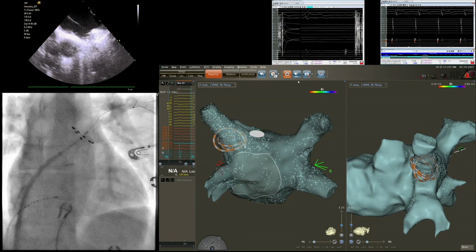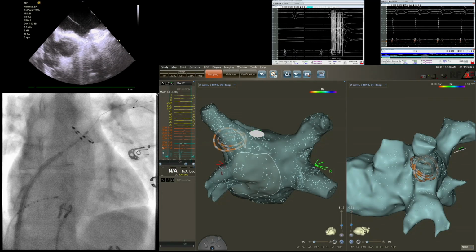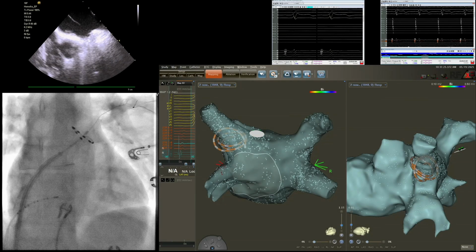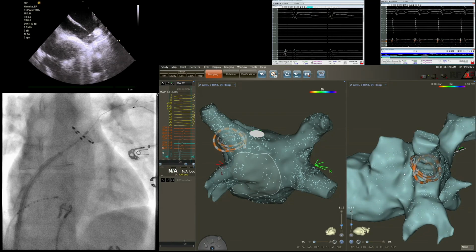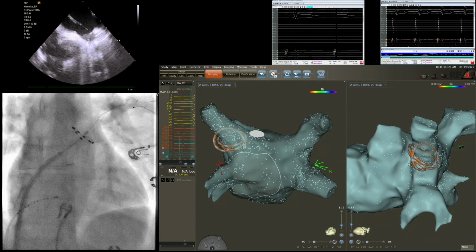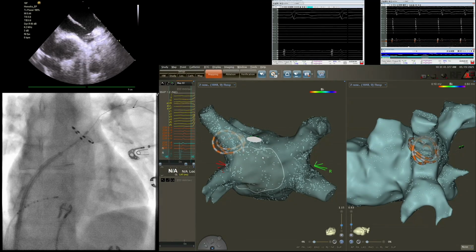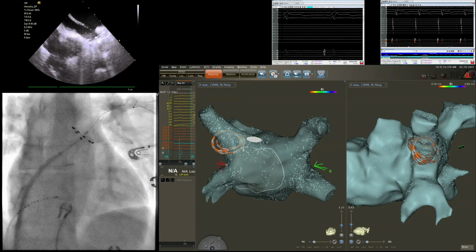Actually, Peppo, I think that we discussed yesterday during the dinner a lot about the ICE. And I think that it might be a good standard for the applications of the PFA technology to go to the left atrium, because the sheaths are a little bit bigger and it's easy to follow the veins, so we can just be there easily. Okay. If you see it from the right, no too much potential, you don't need to go to the left, but I agree that if you don't see it, you can improve visualization if you go to the left.